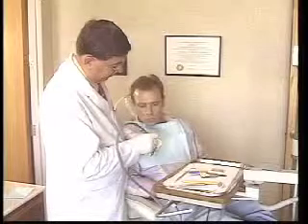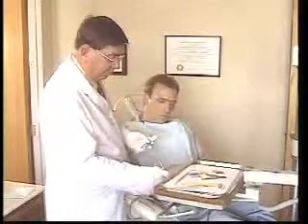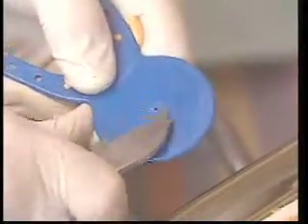Take 50% of the midline and make an X. Using a number 6 round burr, drill a hole through the post-it note and through the mandibular tracing plate. Write the patient's name on the post-it note and place it in his chart as a permanent record. We now have a guidance hole in the tracing plate which establishes the exact position for the silencer.